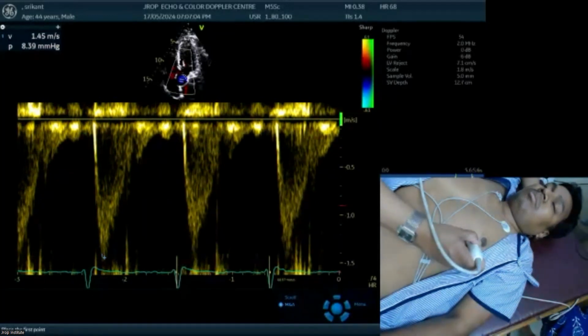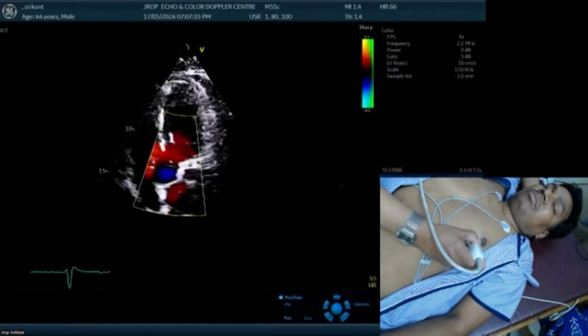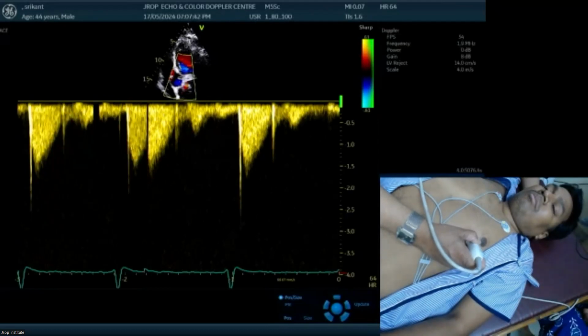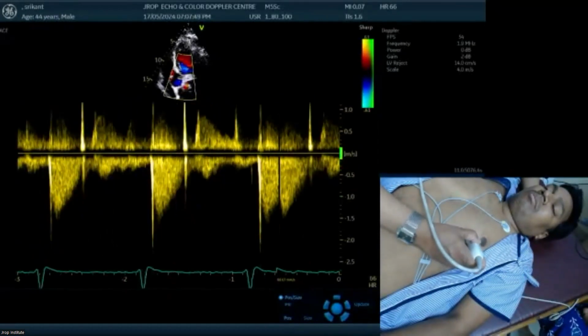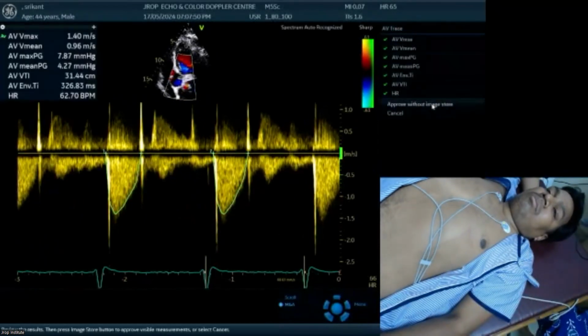Then we switch over to continuous wave Doppler, because that is when we are starting to look at high flow velocity jets. Now I'm doing a continuous wave Doppler. Now look, it's a very clear-cut Doppler spectrum pattern. I can even bring down the baseline also. So this is known as the aortic valve VTI, and that was known earlier as the LVOT VTI. Yes, thank you, sir. Clear?